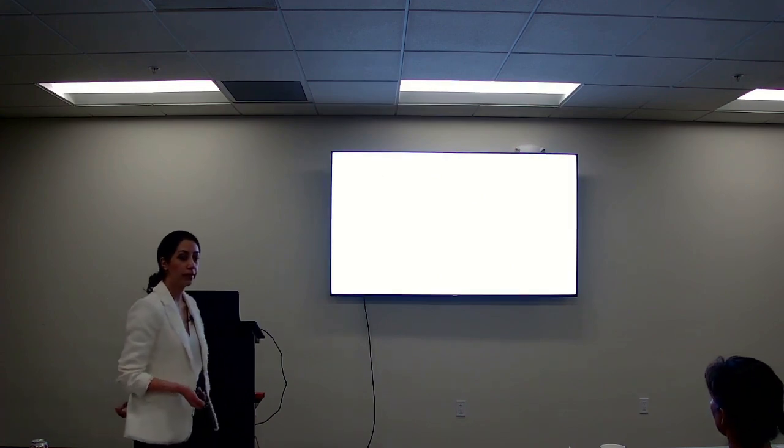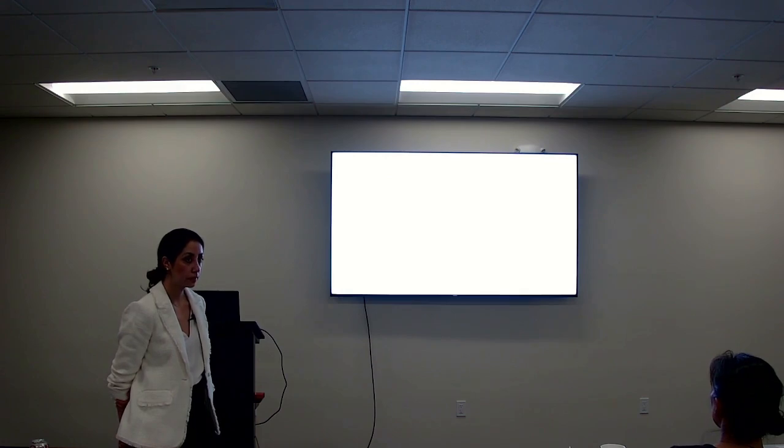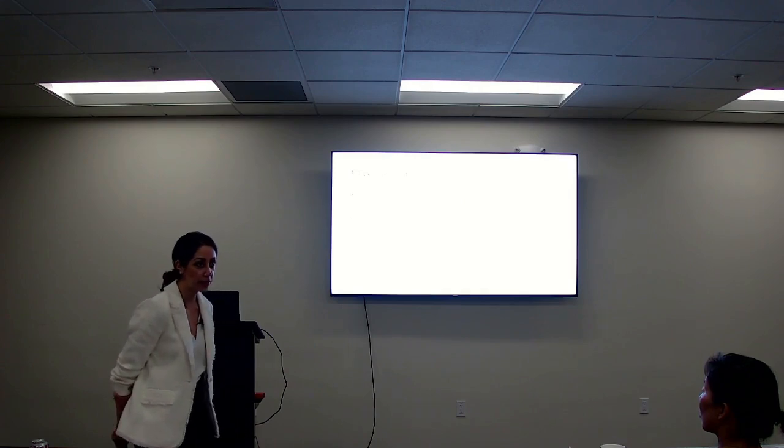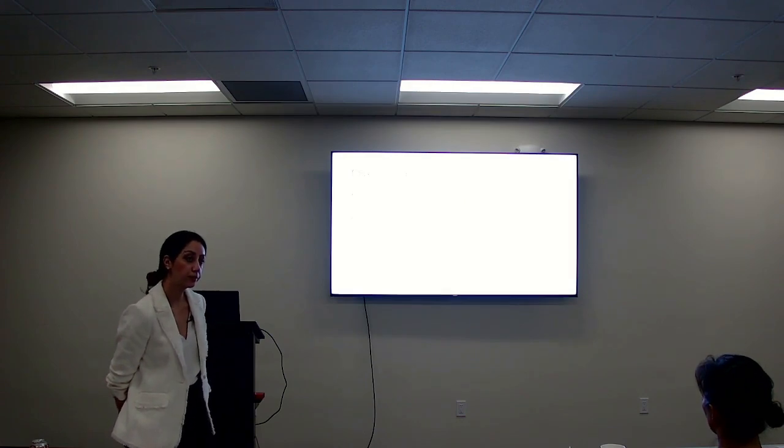Quick question about conventional attachments. Since it's fully engaged in the tray, when patients remove the aligners and put them in, does it wear and tear more easily than the optimized, or not really? Great question. I've actually wondered about that. I don't know if you could visually see it, but often when I put these conventional attachments on and I take their occlusion, if they're biting on it, I just trim them a little bit. Is it making it less effective? I don't think so, because there's still tons of other surfaces to bind to.